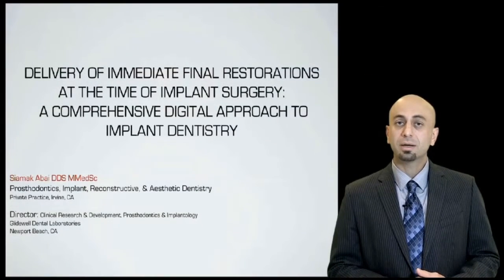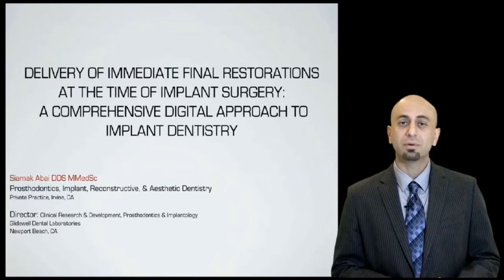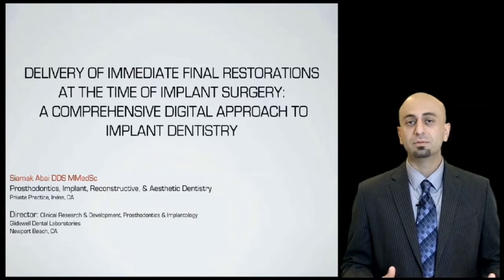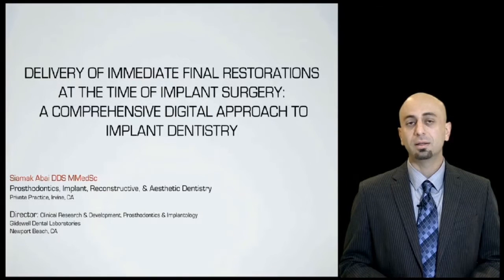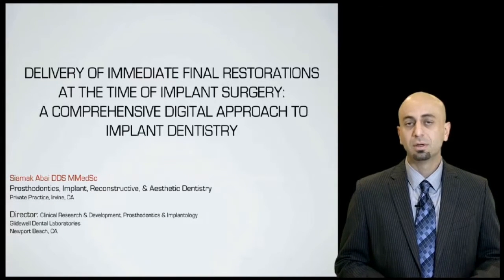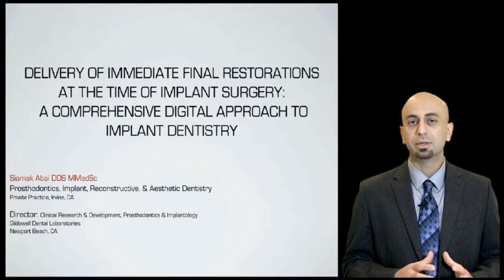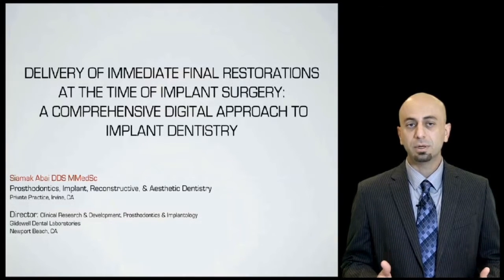So the title of this presentation is Delivery of Immediate Final Restorations at the Time of Implant Surgery. And it's a comprehensive digital approach to implant dentistry. I want to stress that it is the delivery of immediate final restorations. So having all the information, we can fabricate these final restorations even before the surgery has begun.